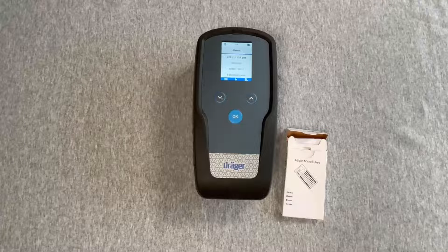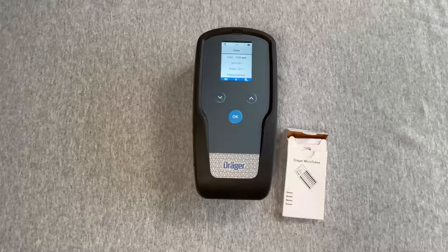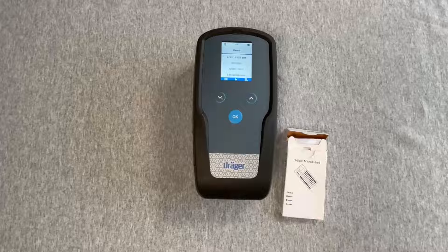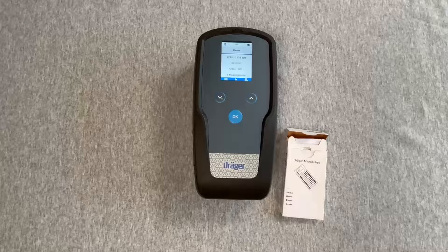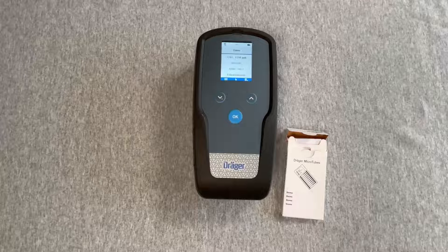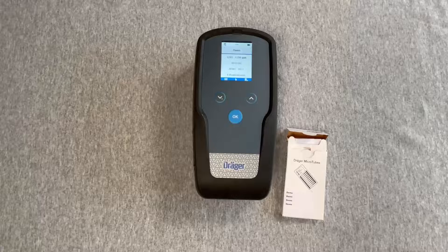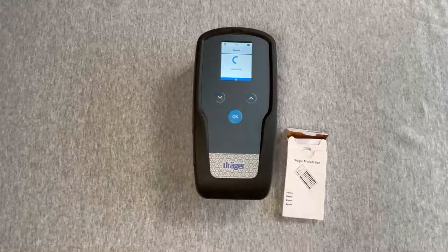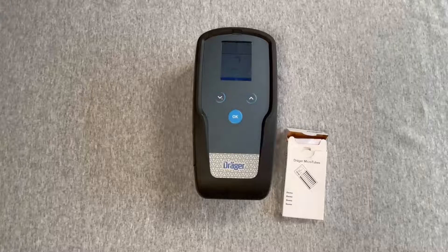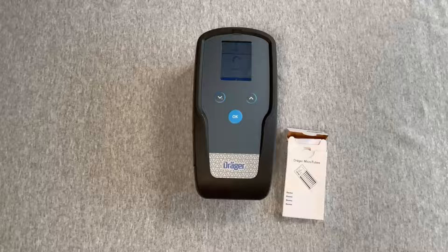Loading will be indicated in the display, followed by the name of the chemical, part number, batch, and number of remaining tests. The white triangle in the blue bar signifies the device is ready to take a measurement. Since the triangle is above the OK button, press OK and a measurement will begin.